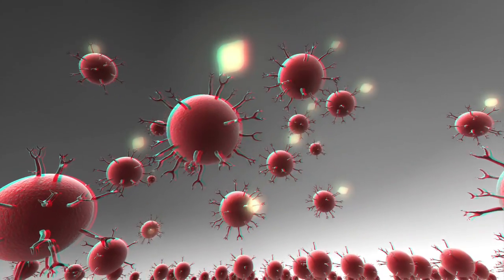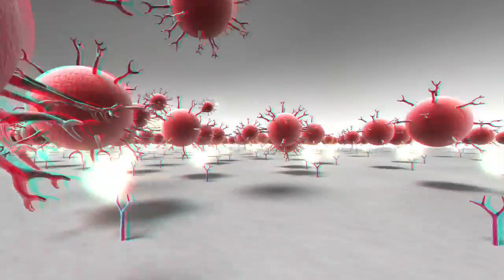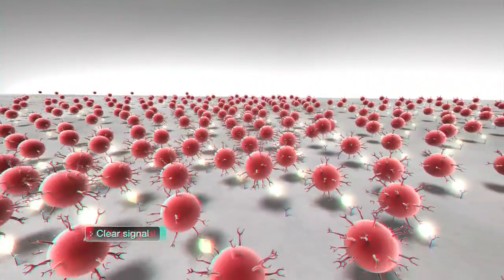As the antigen reaches the test line, it forms a strong bond with the immobilized antibody to form a clear, accurate, consistent signal.